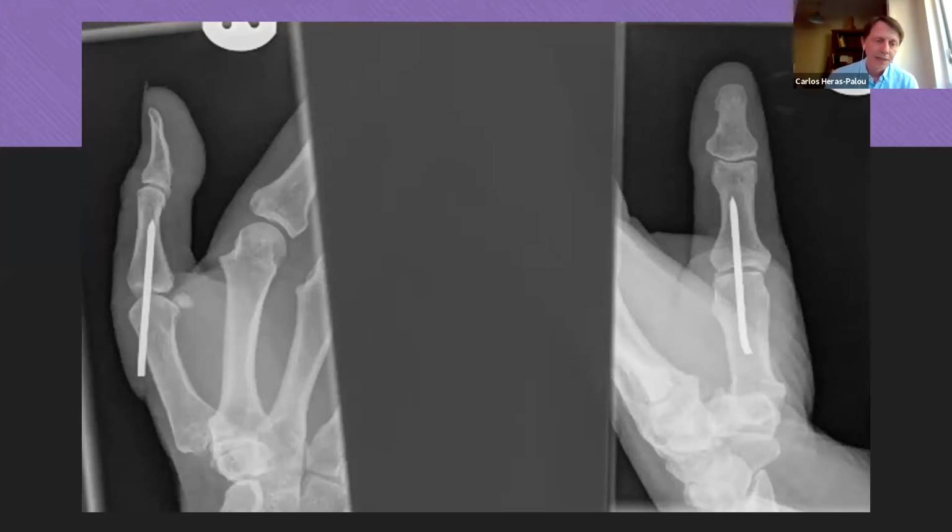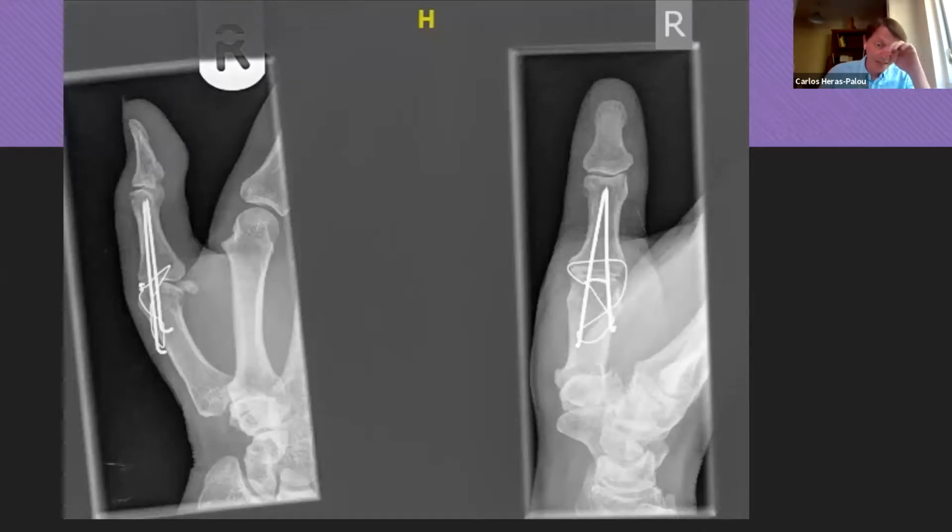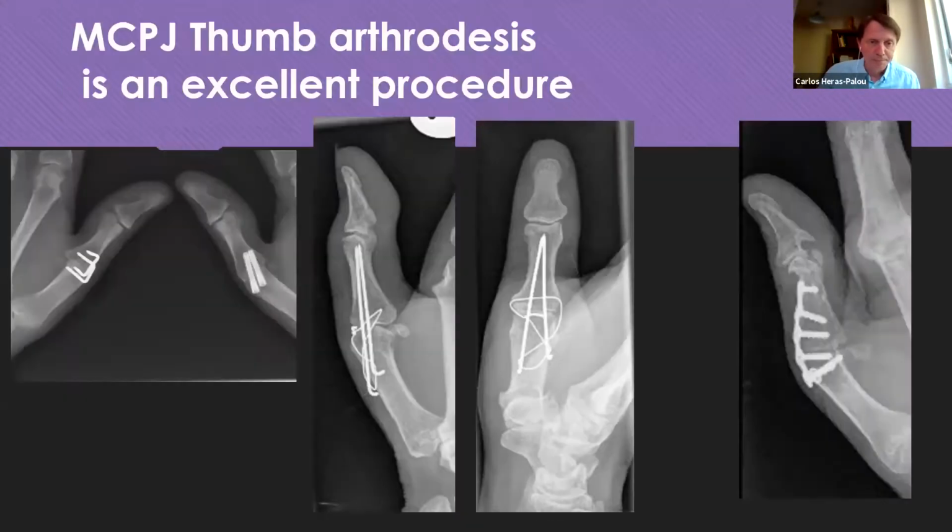And then I see them again in about 4 weeks. And if that has abolished the pain, like it was in his case, he said, "Yeah, I can work with this. I can do everything." Then I take the K wire out quite quickly. Don't give it time to cause complications. And at the same operation, just arthrodesis them. And that sorted out his problem. So overall, MCPJ arthrodesis of the thumb is an excellent procedure.